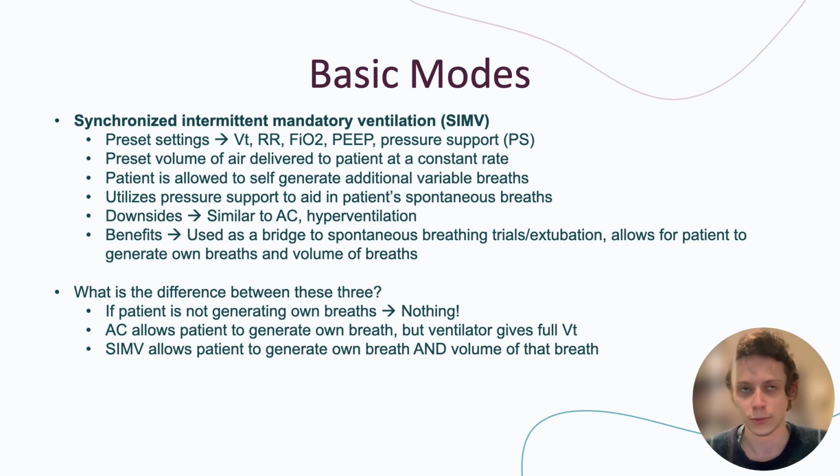So to recap, what is really the difference between these? If a patient is not generating their own breaths, there is absolutely nothing different between these three settings. Nothing. The patient will be given the preset volume of air delivered at a constant rate.